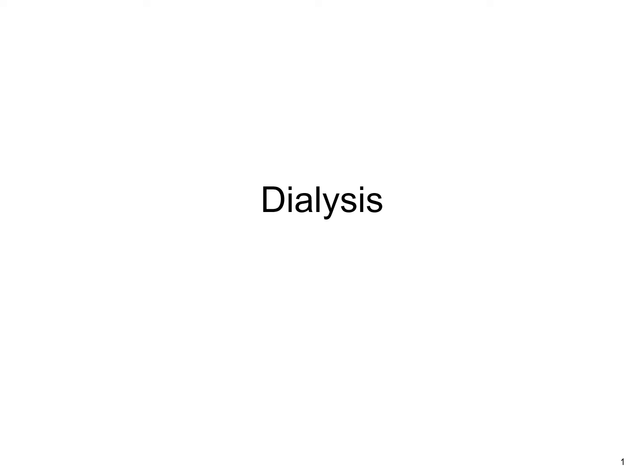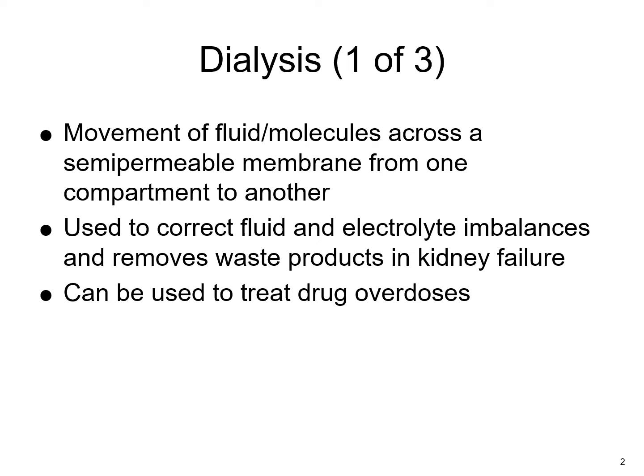So this is part 3 of the kidney disease PowerPoints, and this is specifically talking about dialysis. So we'll talk about hemodialysis, peritoneal dialysis, and some of the CRRTs. So what you want to do is keep everything very simple, all right?